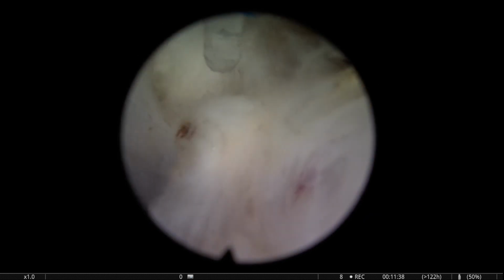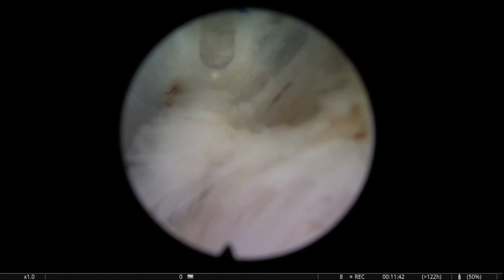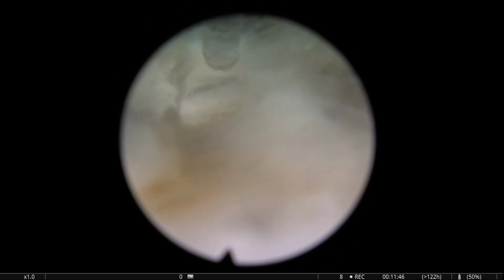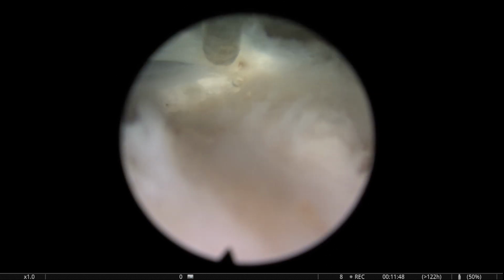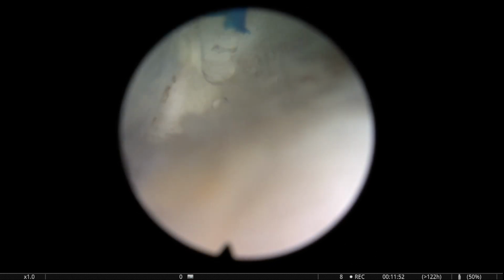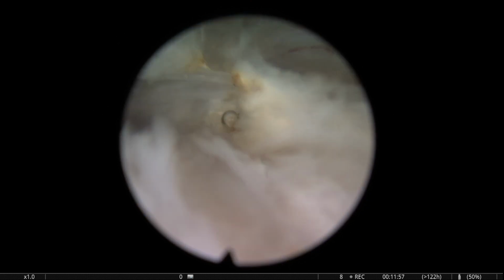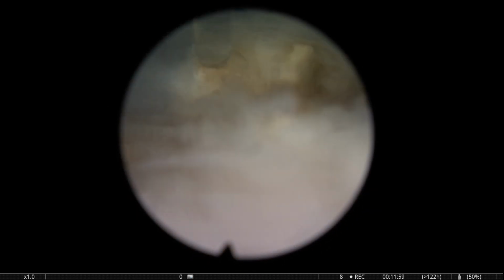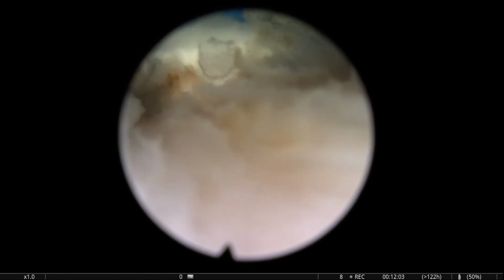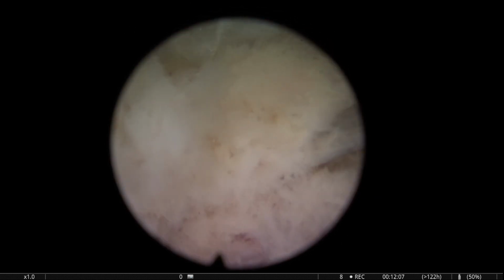You know, here that's anterior. I'm trying to keep a little bit lower than the little perforation we saw there to try to develop a safer plane. But you see, my obsession is always trying to connect with the lines around it so that we can have a broader line of dissection. There you see that we are trying to understand.